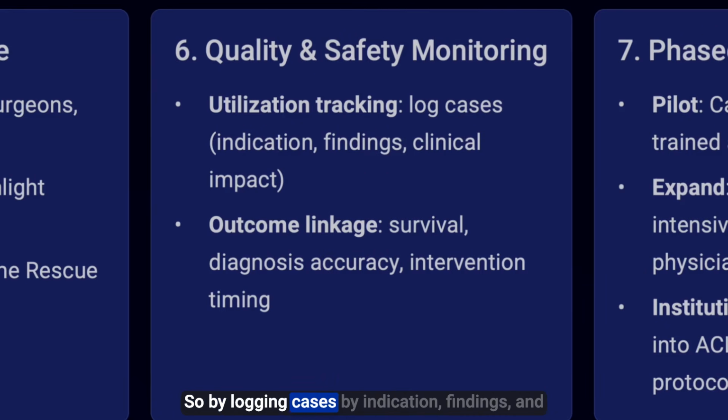So by logging cases by indication, findings, and clinical impact, you can track over time how influential this service is to improving patient care in the hospital, and also assess for outcome linkage. Did this improve patient survival, diagnostic accuracy, time to intervention as well?